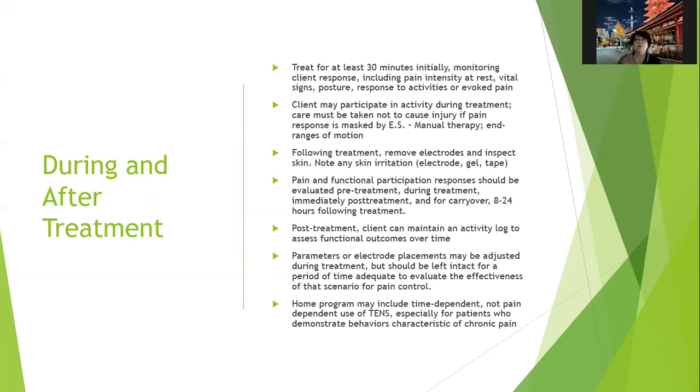Following the treatment, you want to remove the electrodes, inspect the skin, note any skin irritation if there is any. Tell the patient what to do if there is any skin irritation. You want to reassess pain and functional participation responses. So pre-treatment, during treatment, and immediately post-treatment. And also, I like to tell people, take note of how you feel later today, and then tell me the next time you come in. So we can get that little bit longer term assessment.